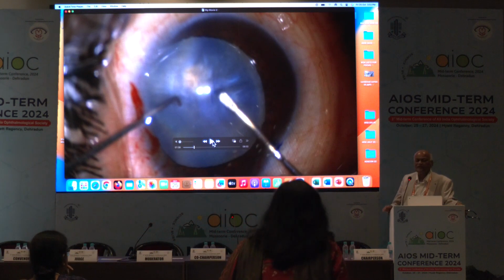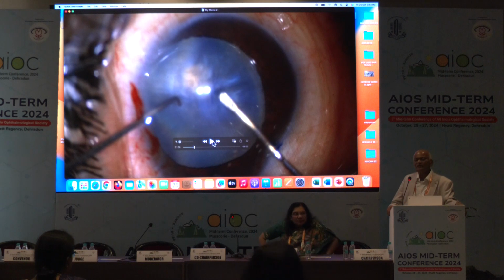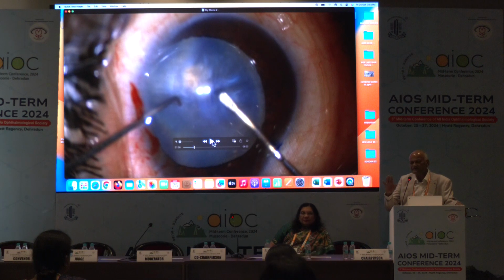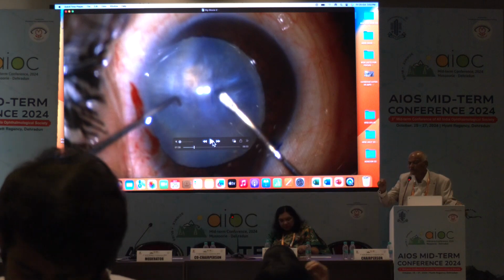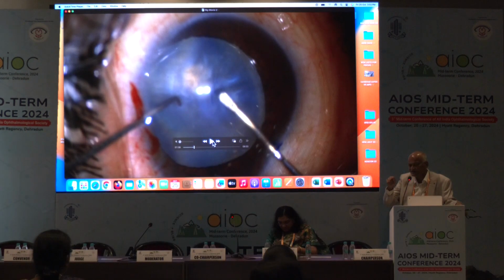In the soft cataract. Now what happens in the soft cataract, when the cataract is very soft, basically when you are trenching, when you have reached proper depth, how you will understand, I will tell you. When you see the glow, the glow in the soft cataract is seen. But when the particular thickness, means 2/3 thickness of the nucleus, is trenched out, the glow in the center shines. Glow in the center shines in the soft cataract also.